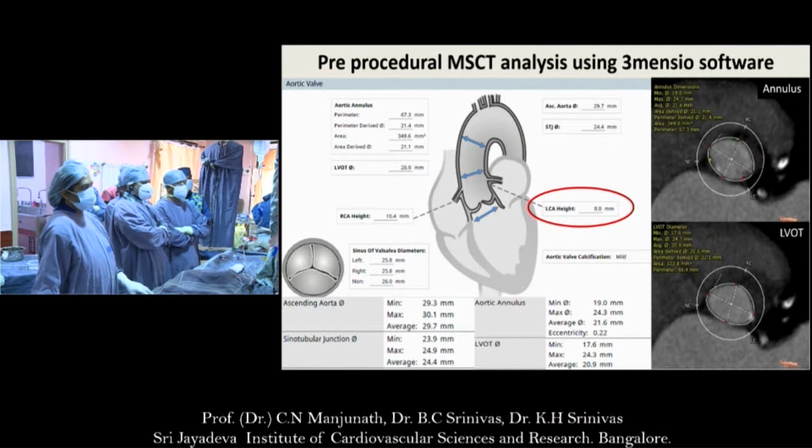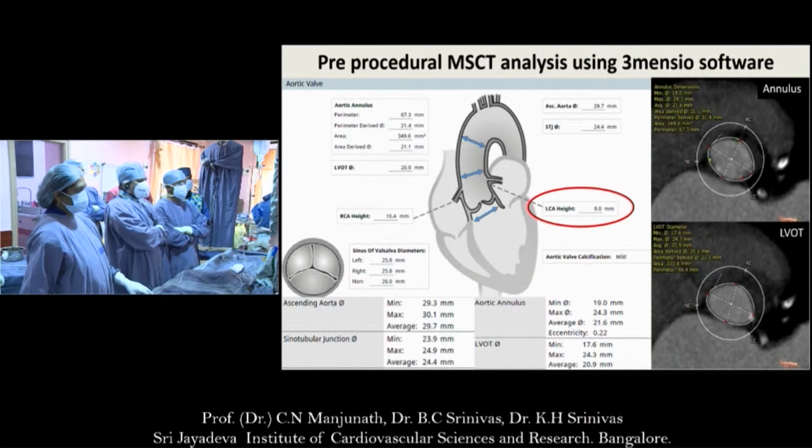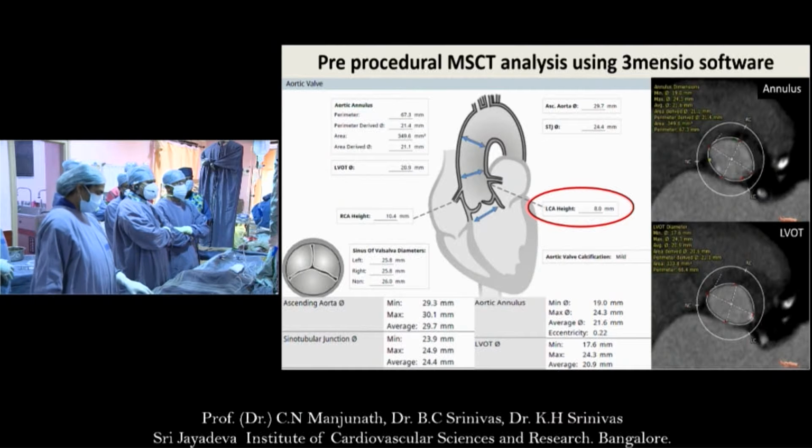Certainly, when it starts getting towards 8 millimeters, I start thinking about it. I think here, just based on what we've seen, you should be okay. But it's not a bad idea to protect it. It's easy enough to do, and the downside is pretty low, in my opinion.